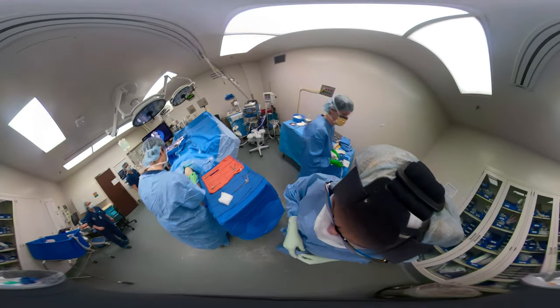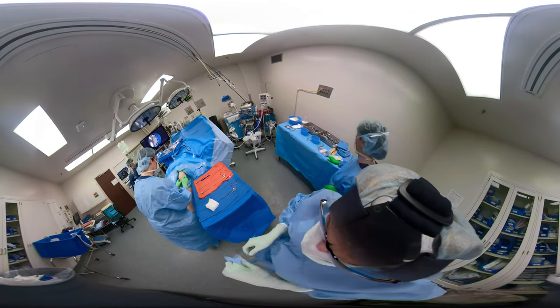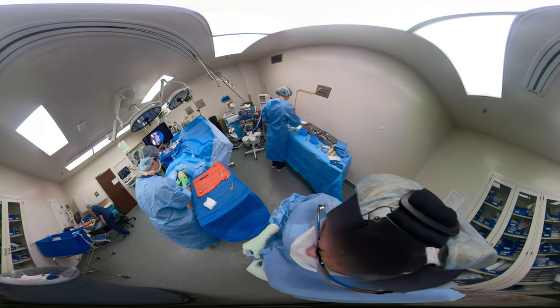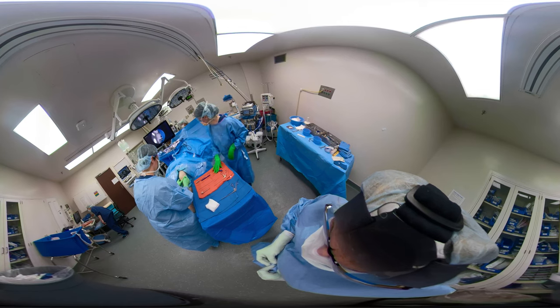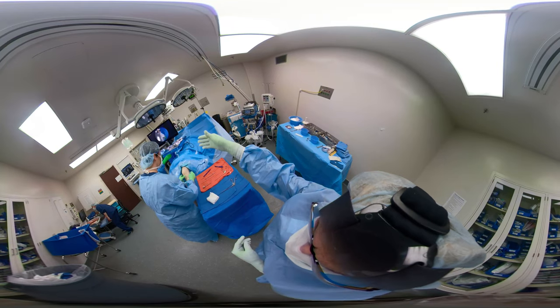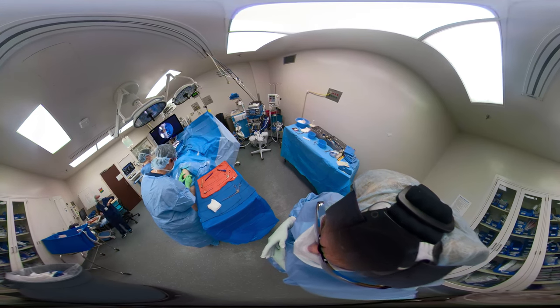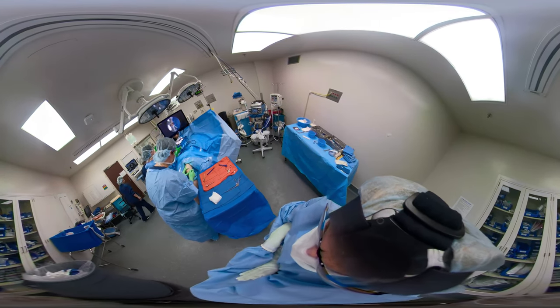The PGY3 resident has prepped and draped, and we're palpating the bony landmarks. The knee is at 30 degrees of flexion. That puts the patella at the correct level so we can move the scope around. If we make the portal in too much flexion, it'll be difficult getting in and out. We do the procedure with the knee 30-degrees flexed.